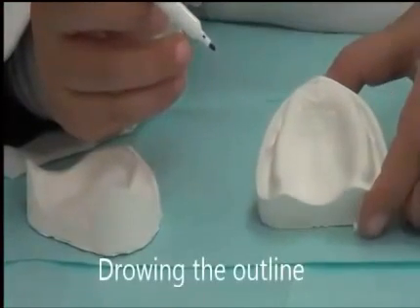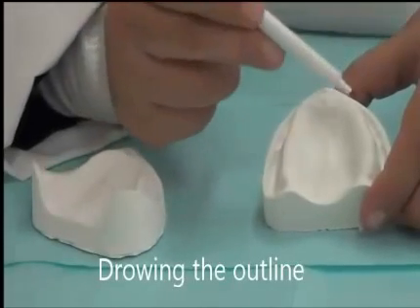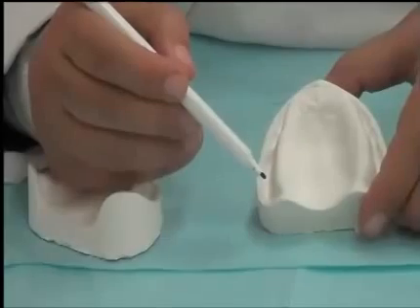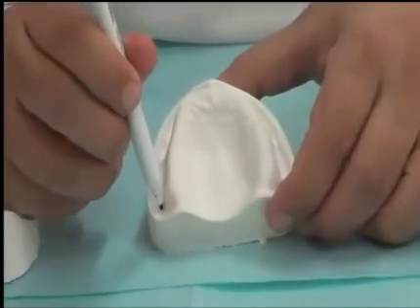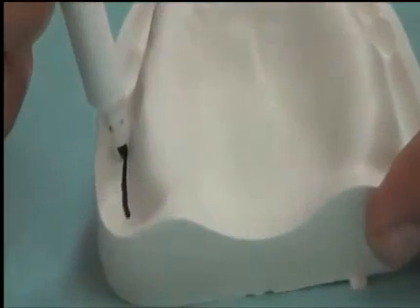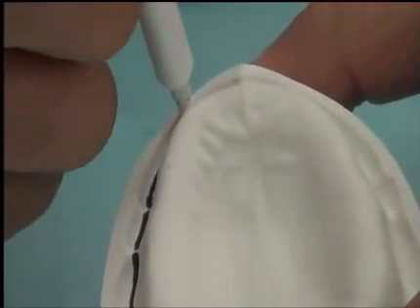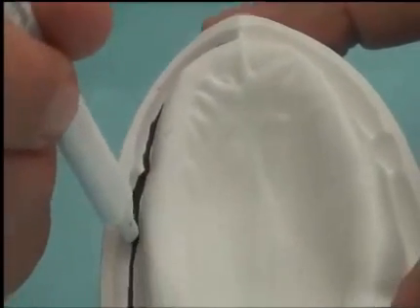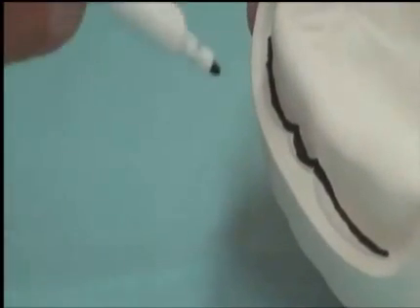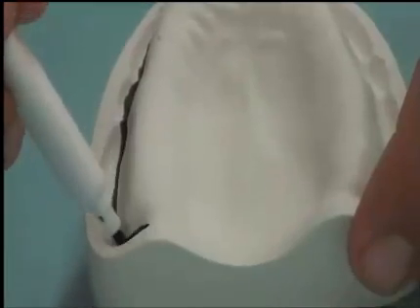So to begin for our first step, we need to outline the basal seat area, which is the area that can come in contact with the denture. We begin by holding a pen. We need to know where the depth of the sulcus is. So we hold the pen vertically and we let it run in the sulcus all around the cast. We will find that on the areas of the freni, the pen will go up and down. And this is the sulcus morphology around the frenal attachments. We also go inside the hamular notches.